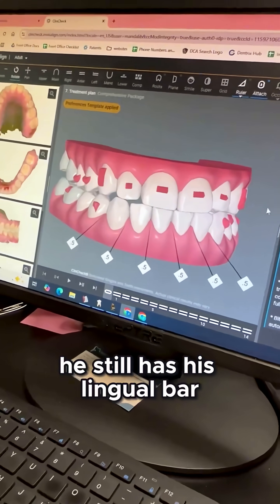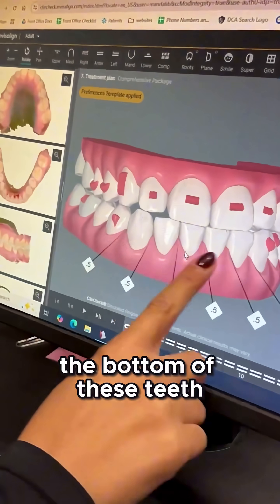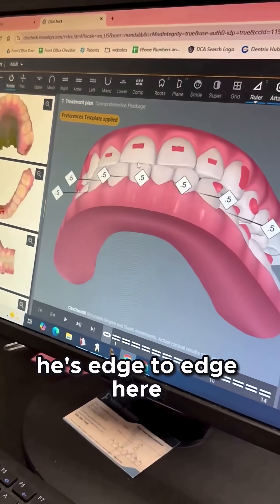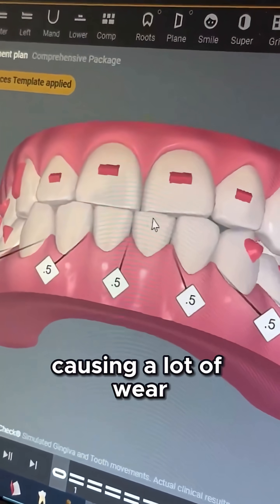So he still has his lingual bar — he had an entire wire in the bottom of these teeth that kept them in place. But you could see his bite: he's edge to edge here, which means that the upper and lower teeth are hitting against each other and it's causing a lot of wear and tension.